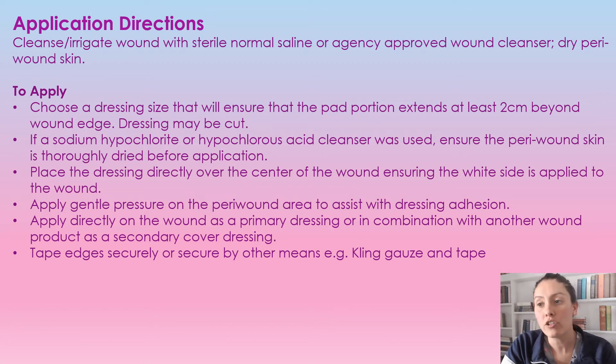To apply the dressing, we're going to make sure that the pad portion does extend past the wound at least two centimeters. This dressing can be cut, but just make sure that it does extend past the actual wound borders by two centimeters. And if you're using any oxidizing agents such as hydrogen peroxide, make sure you are drying off the peri wound very well before you apply.